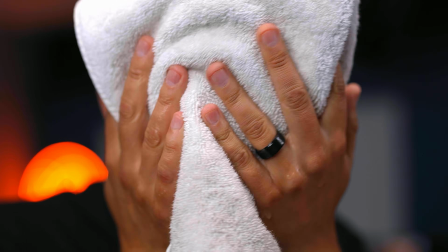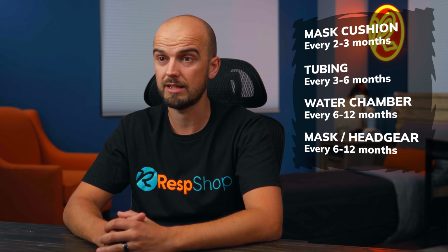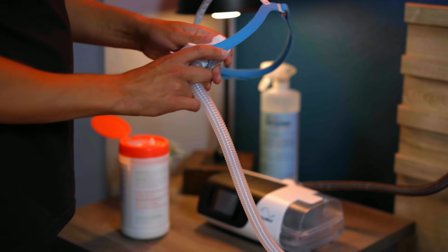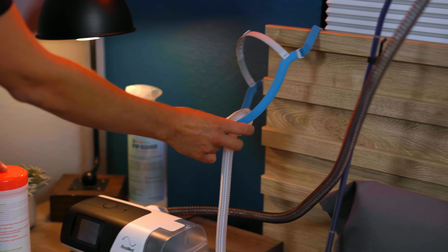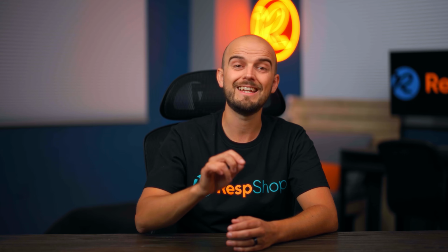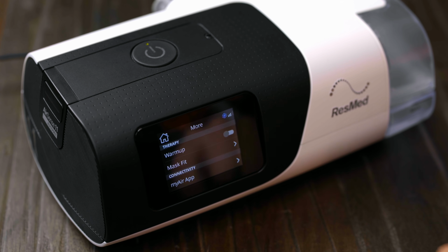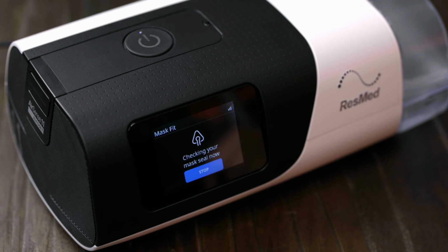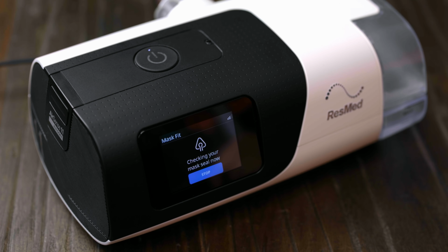I like to wash my face with a gentle soap before bed, and make sure that your cushion is free from oils as well by changing it at the recommended replacement rate, and keeping it clean by using mask wipes and regular soap and water cleaning. The way to know if you're in the sweet spot for minimizing leaks is to run a mask leak test before you sleep. These are pretty standard for CPAP machines now, so check the menu for running that. This will test your mask with your therapy pressure and tell you whether your seal is good before you sleep.